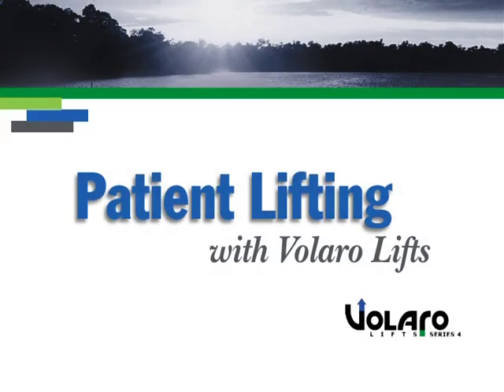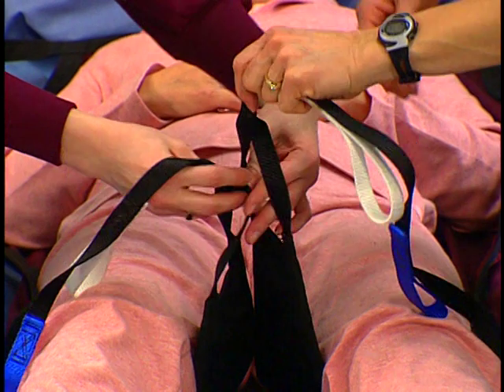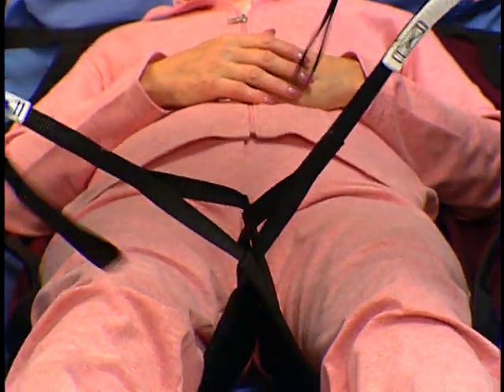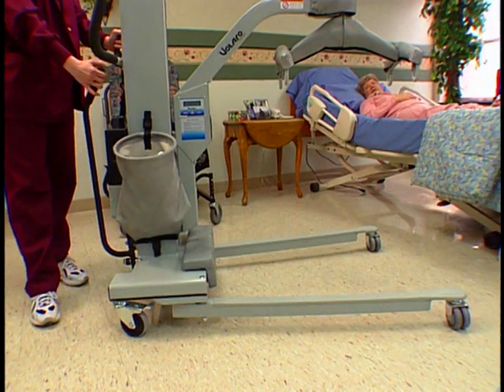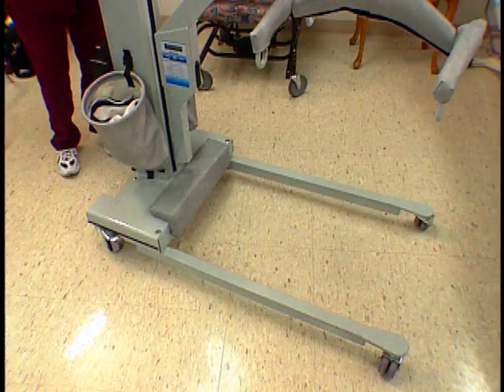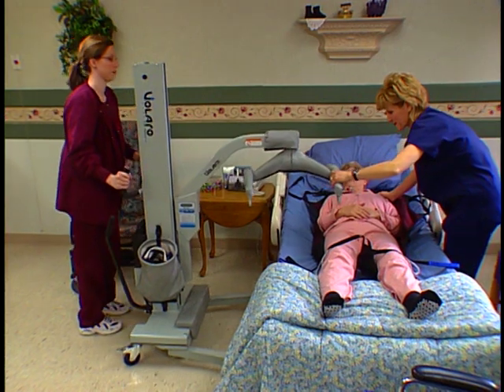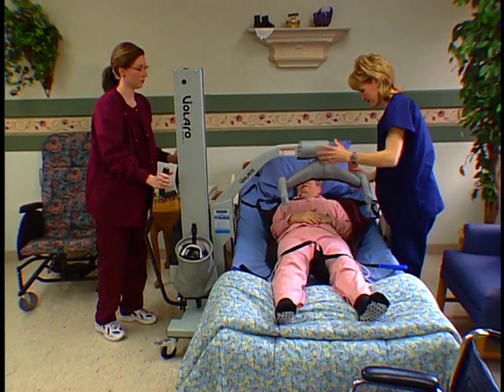Patient lifting with Volaro lifts. Bed to chair transfer. With the sling properly placed, you are ready to transfer your patient from the bed to the chair. Check that the legs of the lift are at the widest position possible. If the base must remain in a narrow position, widen the legs of the lift when it's out from under the bed. Move the lift into position by centering the hanger bar just over the person's navel.